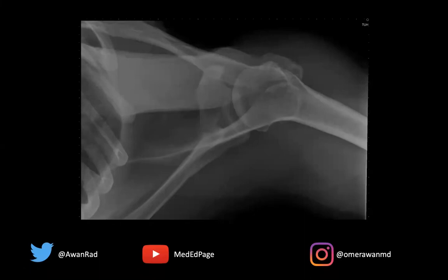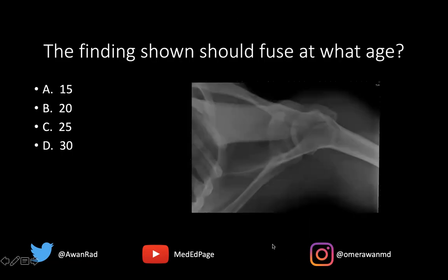Hello everyone, and welcome to MSK Unknown Case Series, Case 76. We have a great case here. We have an axial radiograph of the shoulder, and the question is: the findings shown should fuse at what age?